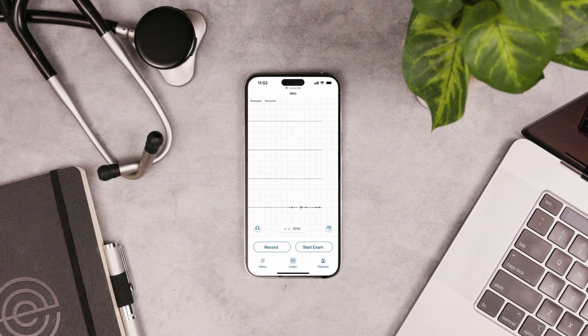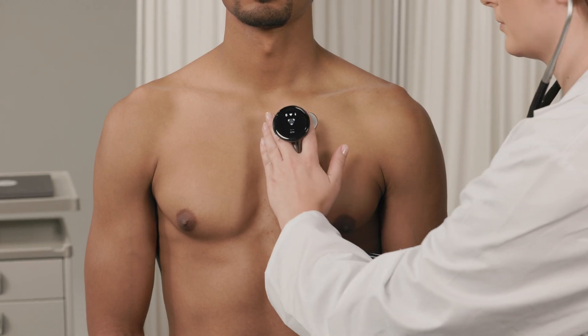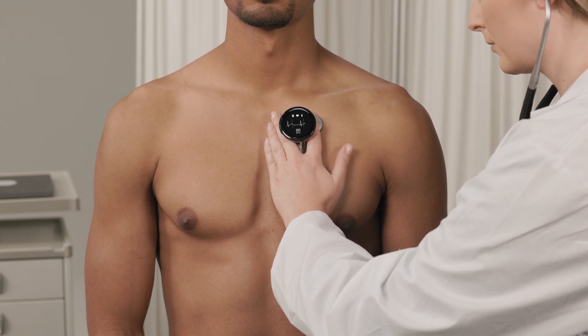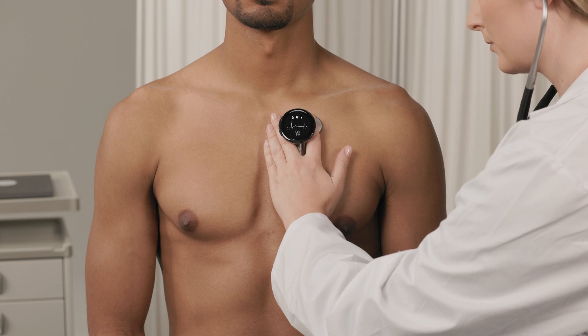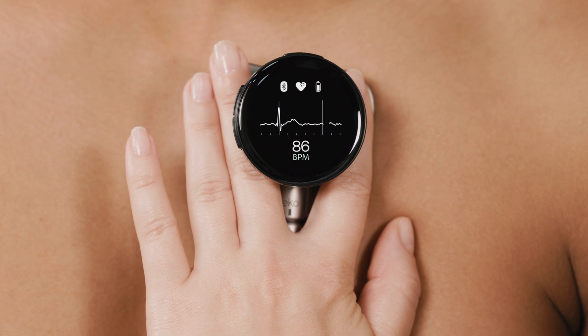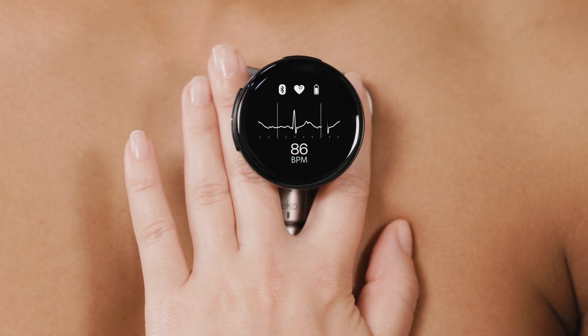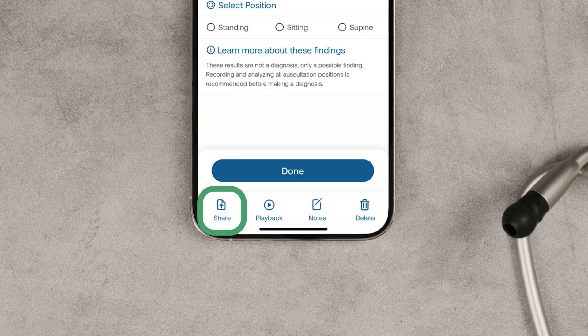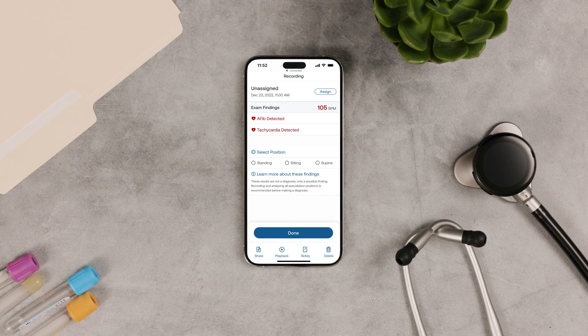Now let's take a recording. Place the device on the patient. Recording begins automatically if the Record automatically setting is on. Keep the device still for best analysis and audio quality. You can see the recording and analysis results on the summary screen. Here, you can also export or print the recording by tapping the Share button. You can export the recording with text message, email, or any other options on your mobile device.